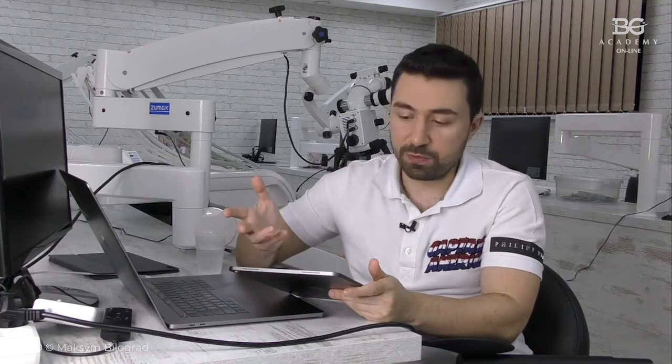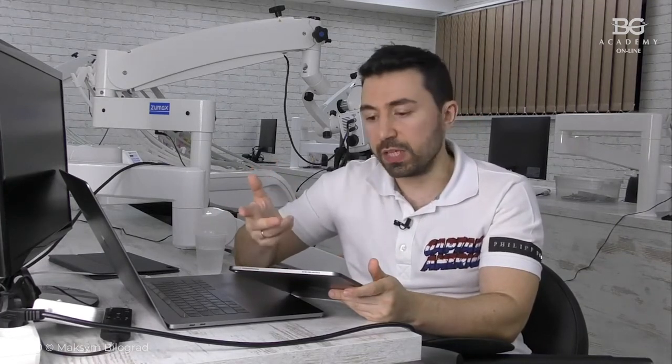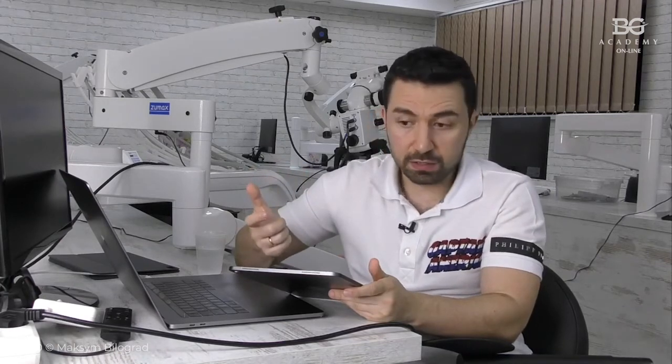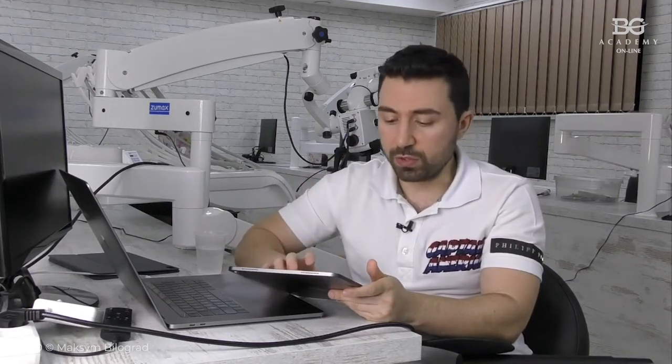It depends again on how bad the fit is after cementation. But there are two options to remove the veneer. You prep again, okay. And another option is to use an erbium laser or water laser, and you can remove the veneer with the water laser.